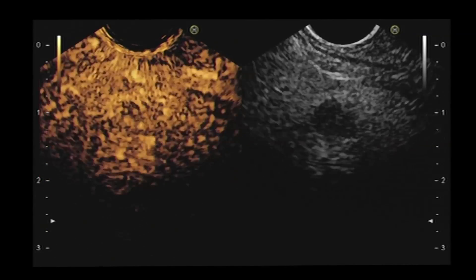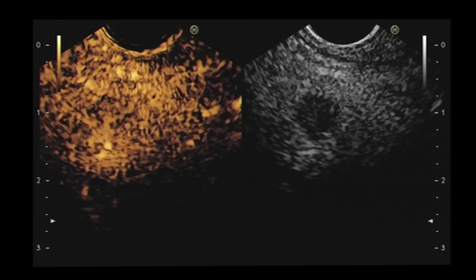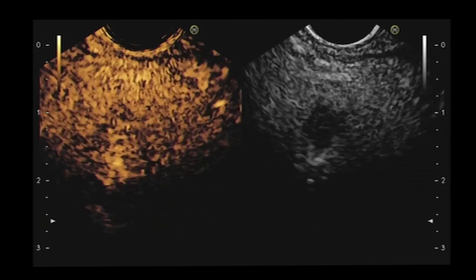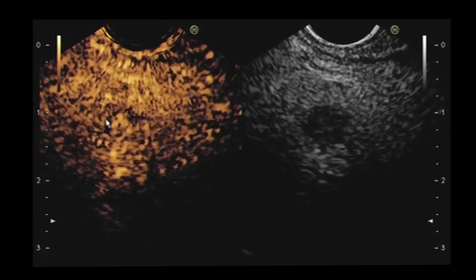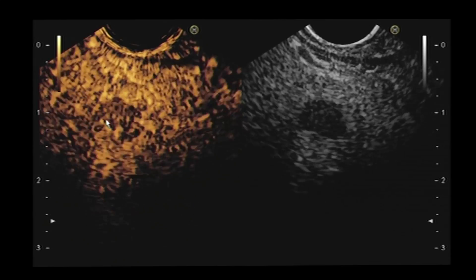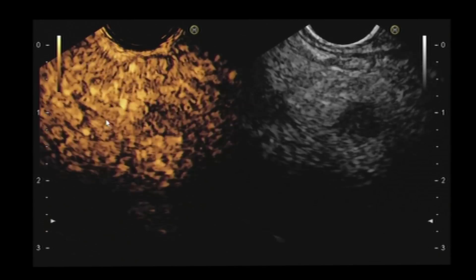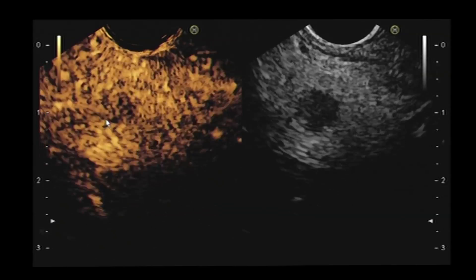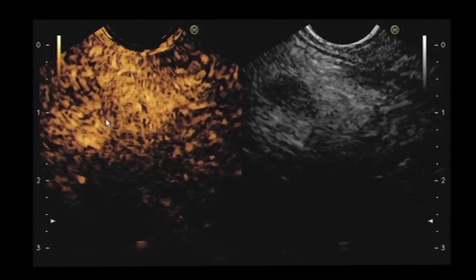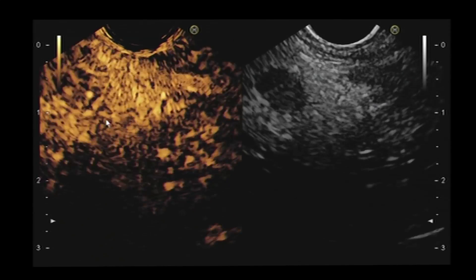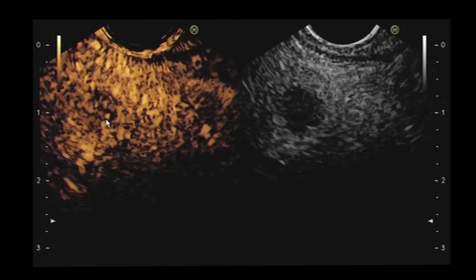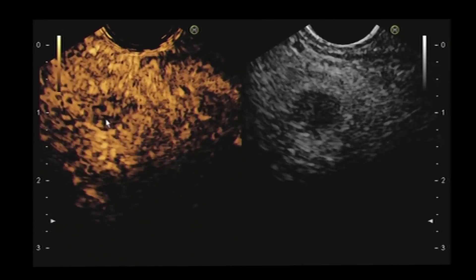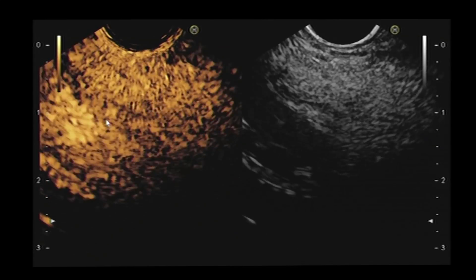The second sign is the washout. You have a quick washout and you will see that the bubbles will disappear quickly. If we wait after one minute, there is a washout of the lesion. You see now the lesion becomes again hypo. You see the washout. This is probably a neuroendocrine tumor.